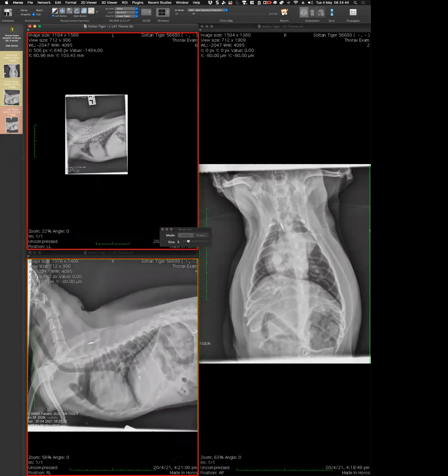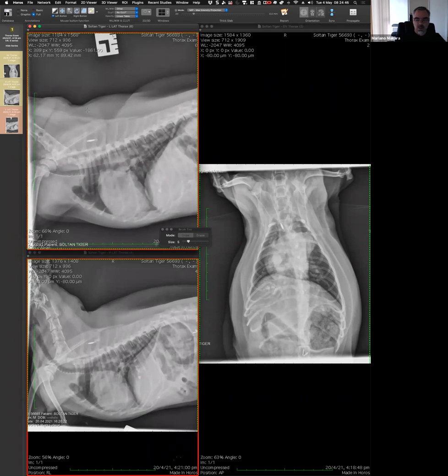Okay, so I don't know how we want to go about this. I can see two options, as we always do. One is that people object to some other people's comments and say, I disagree with that. I don't think it's there, or I think this is the case, or I think probably this is not going to work in this case.